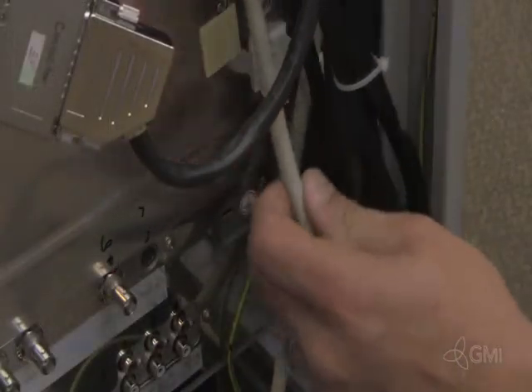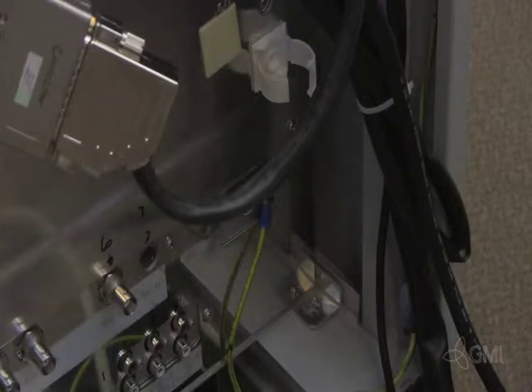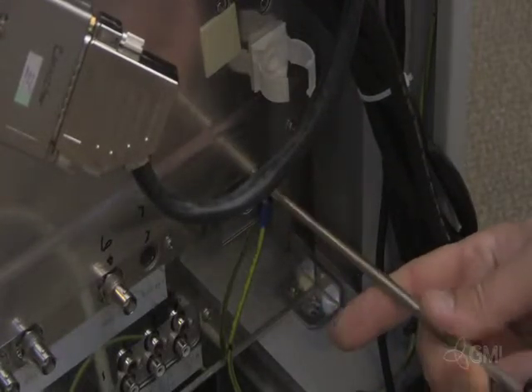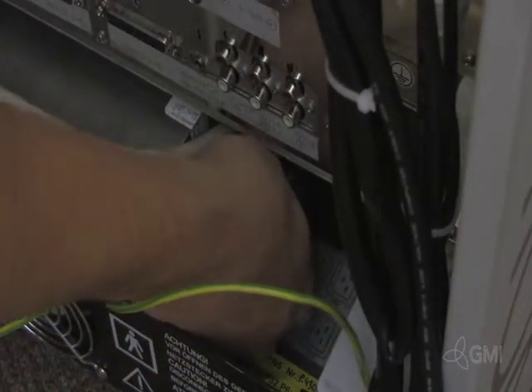Remove the ground cable from the e-box assembly. Remove the ground cables from the main power supply.